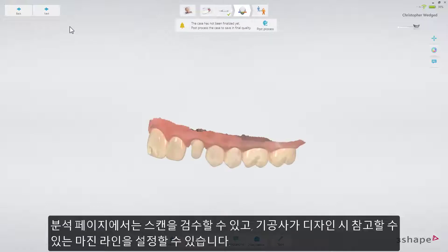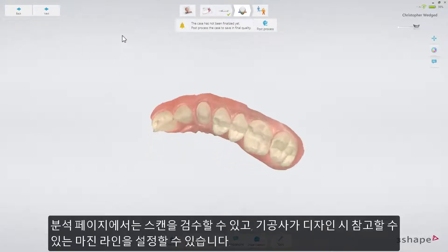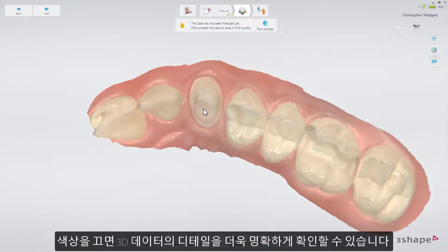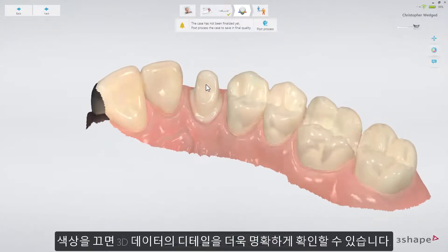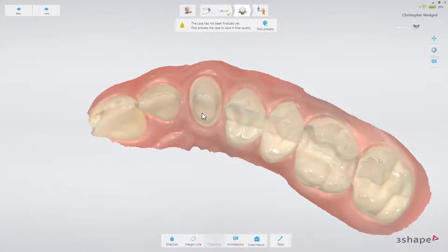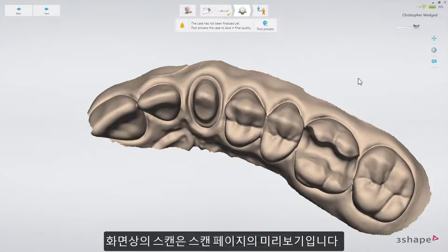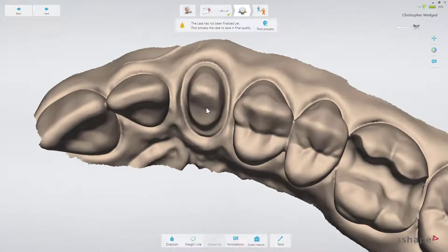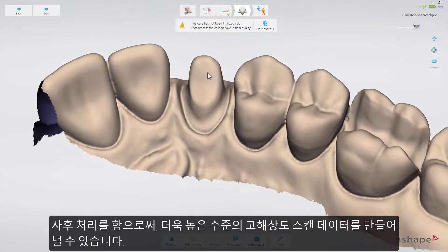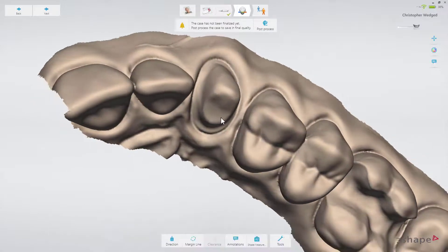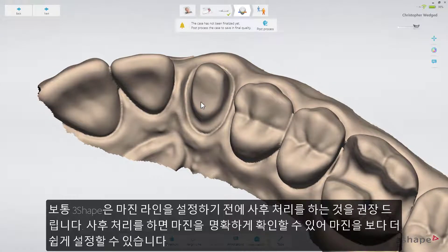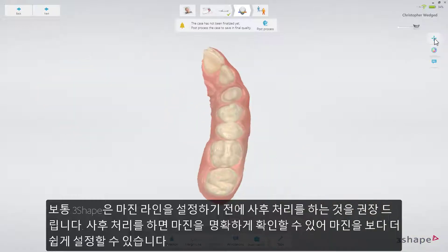Once on the analyze page, you can examine the scan and set the margin line, serving as guidance for the technician. Turning off the colors will in many cases make the 3D detail stand out more clearly. The scan shown on the screen is the preview from the scan page. By invoking the post-processing, you will bring out even more detail. Let's illustrate what to do and the difference it makes.